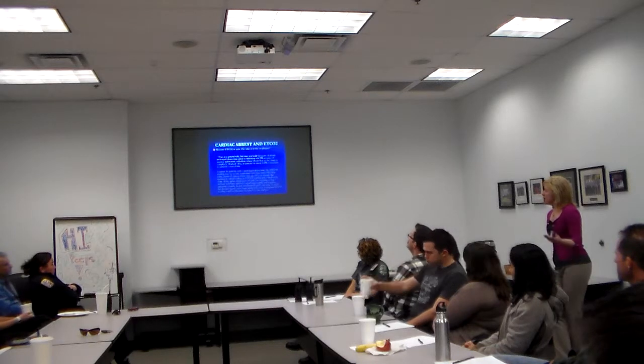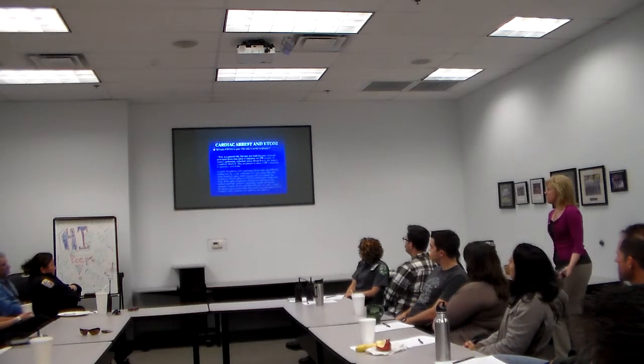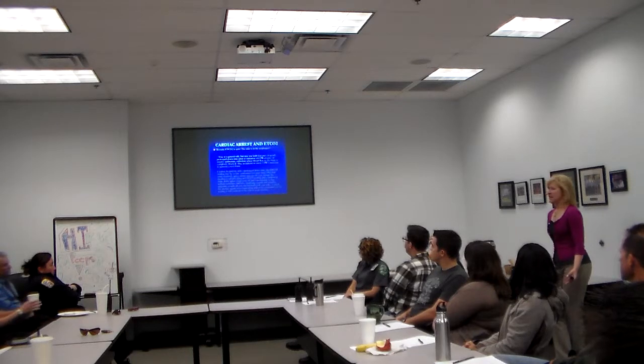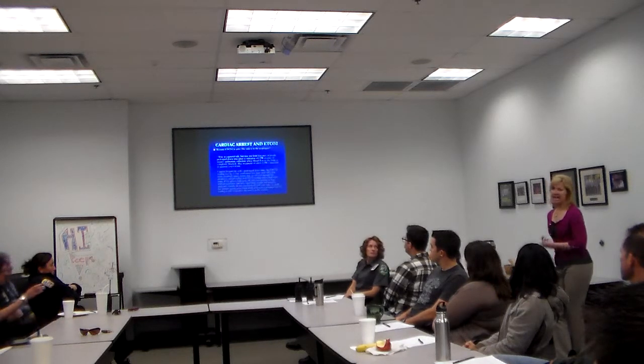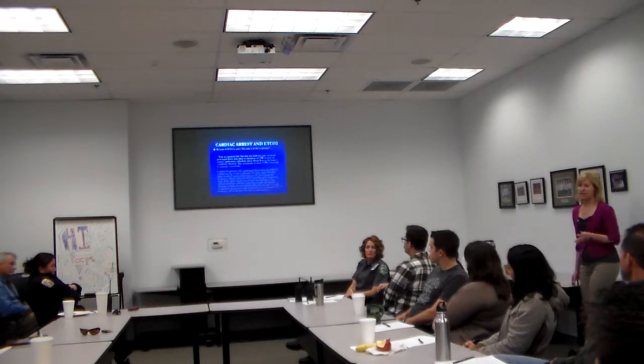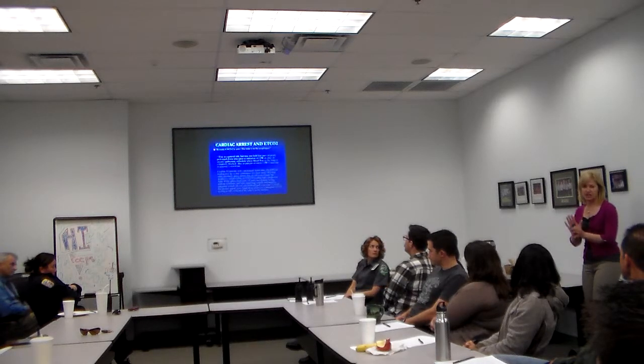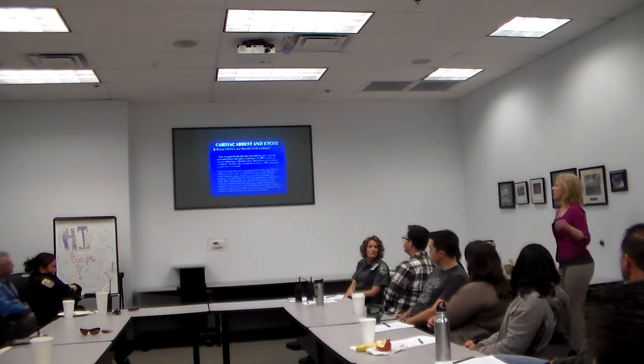So reasons for end-tidal being 0, as we talked about, is that the tube's in the esophagus. Also, it could be for patients who have had prolonged downtime or rare cases like a massive PE where you're just not getting any flow to the lungs, and so you could have a 0 end-tidal. But that's just a very rare case. Also, in patients in arrest, CPR is necessary to generate a waveform. Just remember that too, because sometimes you start bagging, it's like, well, I don't have anything. Well, you need to do CPR. You need to have perfusion going there.